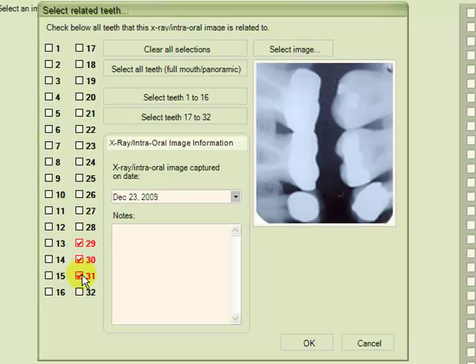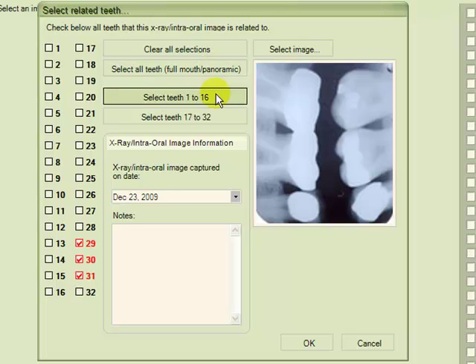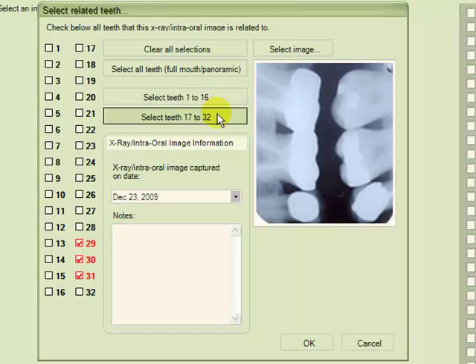If this was a panoramic view, we could select all teeth here, or if it was a section of the mouth, we could choose 1 to 16 or 17 to 32.